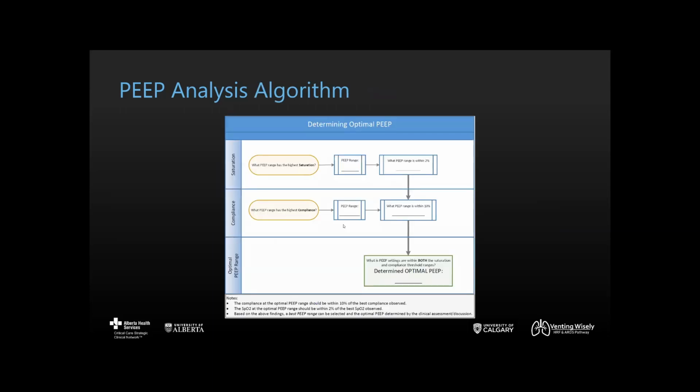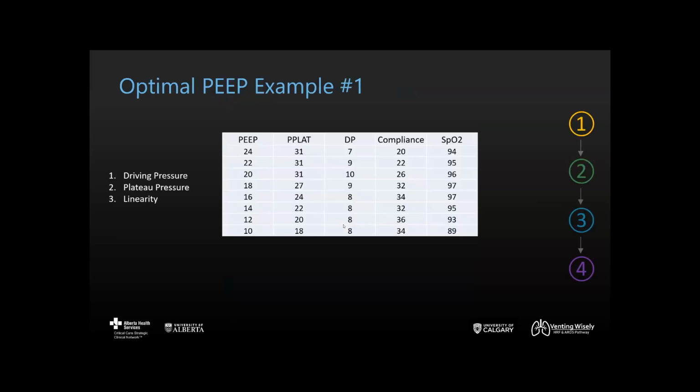Our team has created a reference for helping to narrow down the ideal optimal PEEP for your patient using the methods described in the earlier slides based on the considerations for compliance and saturations. So let's go through another PEEP table example. Using a printed algorithm to help guide you, let's break down this PEEP table.